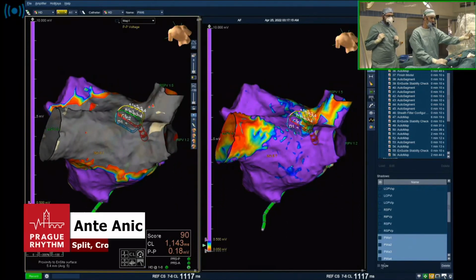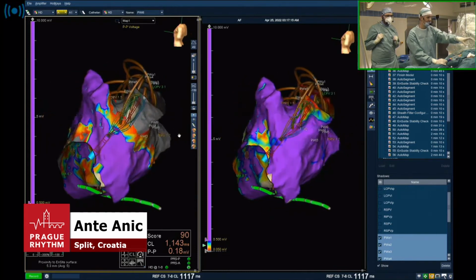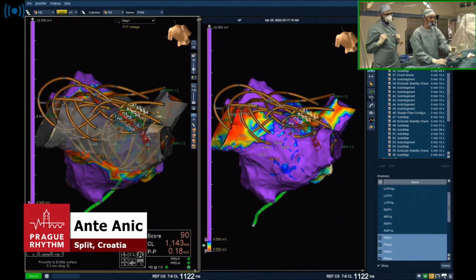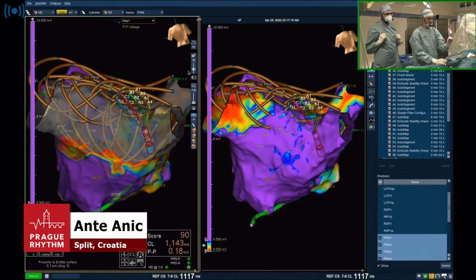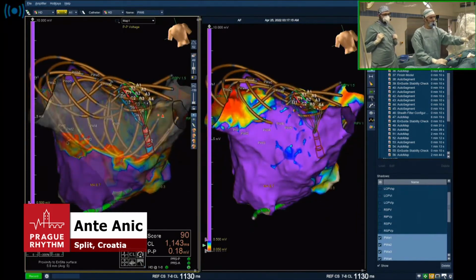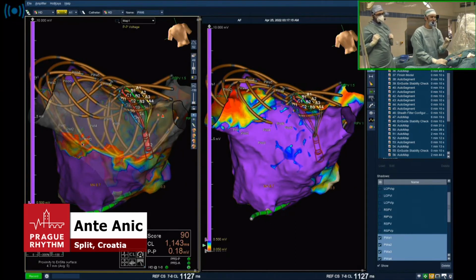Jan, can you show us the left LAO view? Transparency, please. Go back to PA, sorry, Jan. Can you show us transparency? So now you see the correlation of our lesion set. Jan, can you go lower?